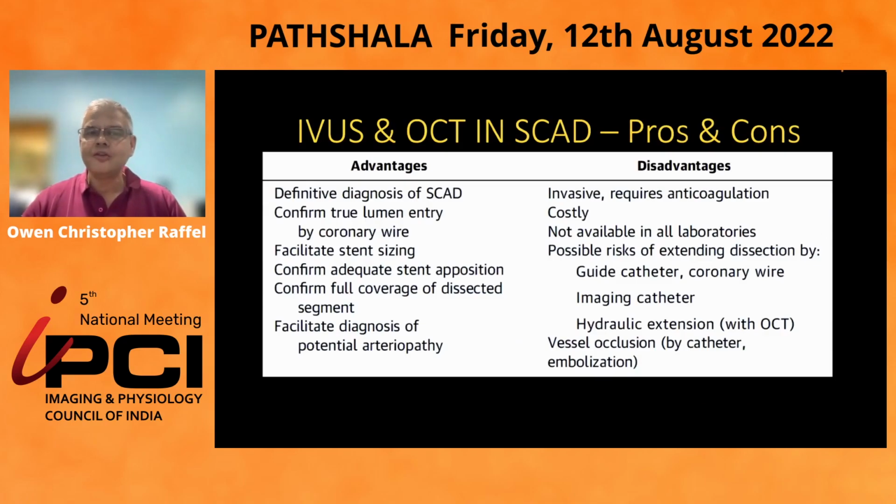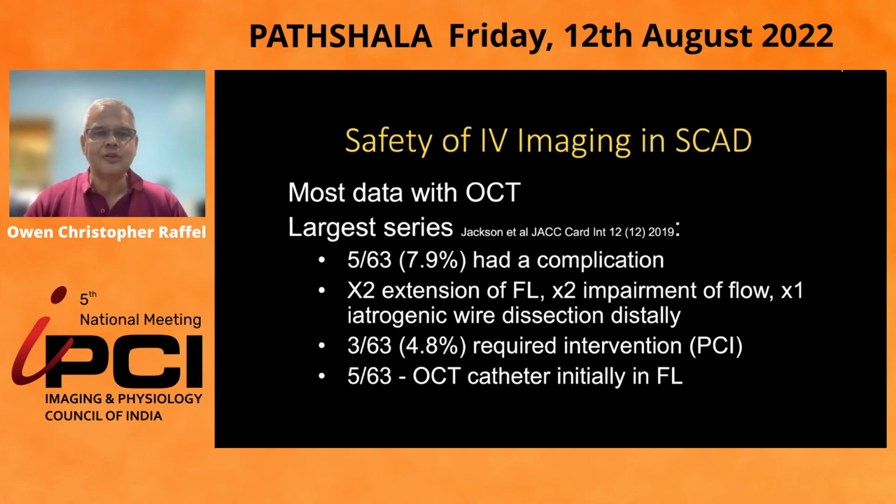Advantages and disadvantages of intravascular imaging? Well, the bottom line is if you have to use intravascular imaging in SCAD, you have to use it. So you have to accept the disadvantages.